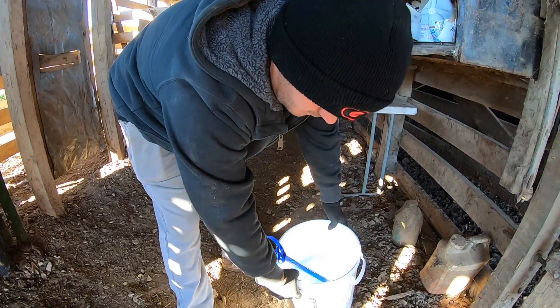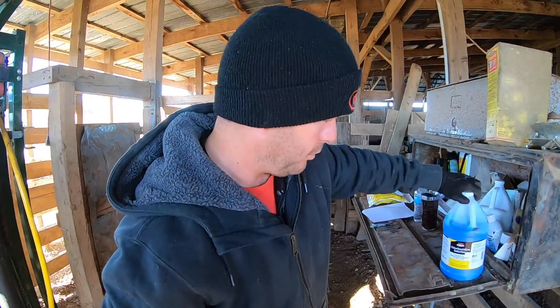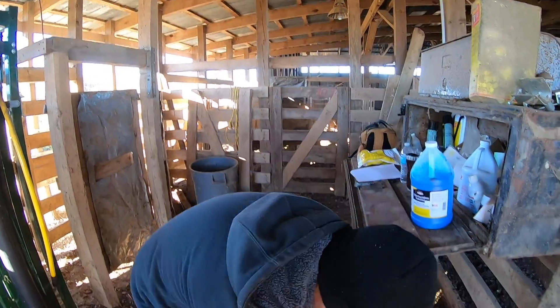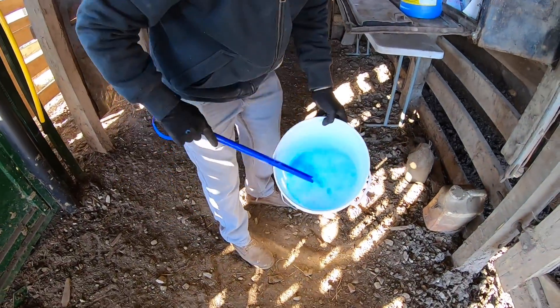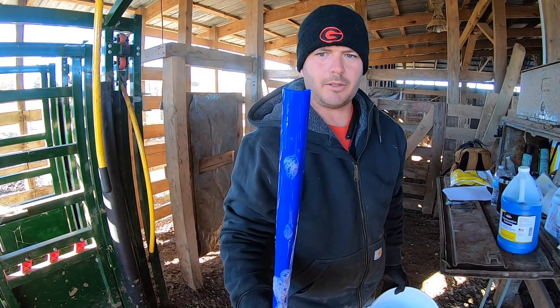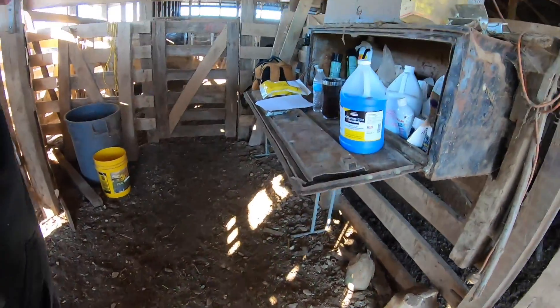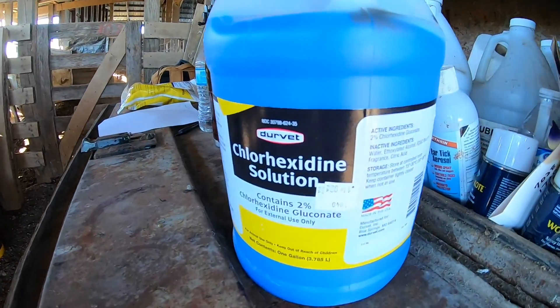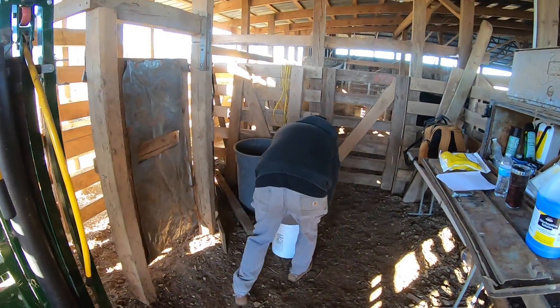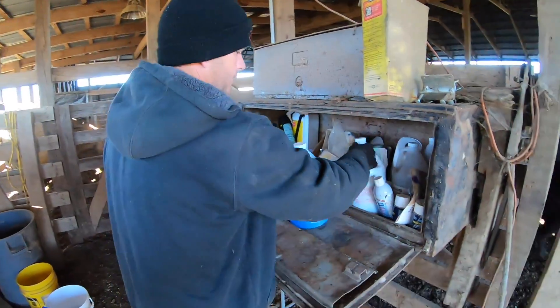Just getting them cleaned up, lubed up, ready to go. A little blue solution — a little dab will do it. That's our CIDR applicator, and this is our bucket of disinfectant. We need to get a little lube too. Everything's got to be lubed up.